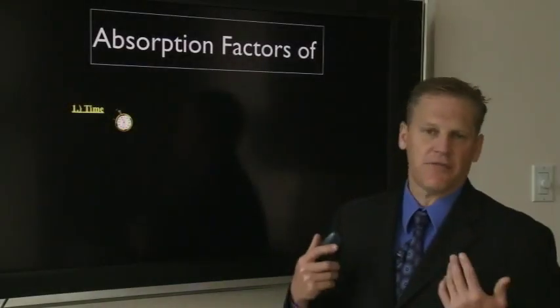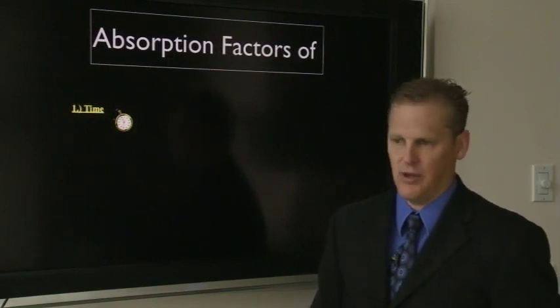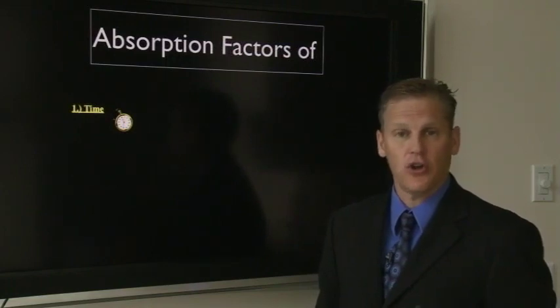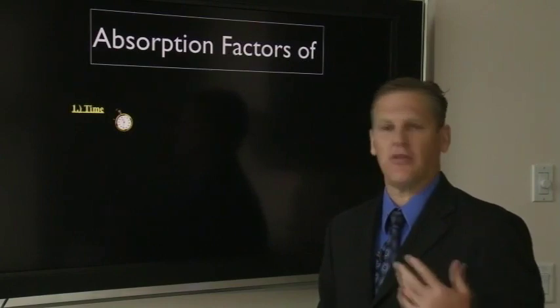There are a variety of factors that can affect how the laser interacts with the tissue. Some of these things are very simple. Time. The basic element of time, the longer you leave the laser on, the more cutting it will do, the more thermal damage it will do.